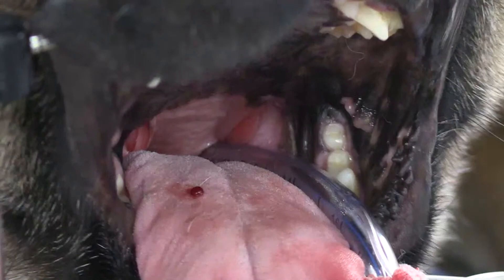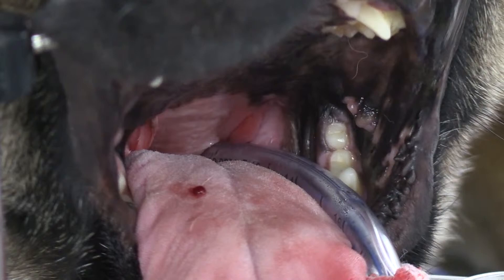Now we can see our soft palate in there. We can see the tonsils on either side. I'm just going to have a feel. I'll need some long DeBakies and I'll need to have my coblation on.